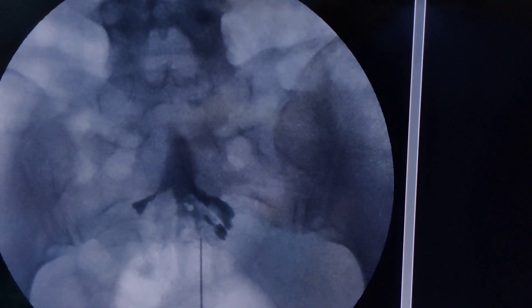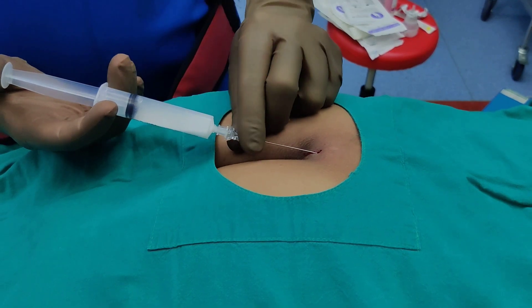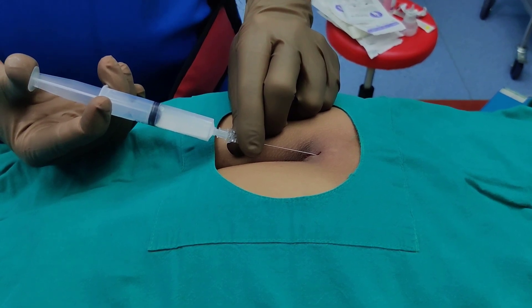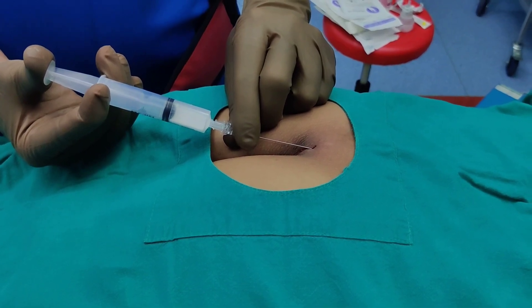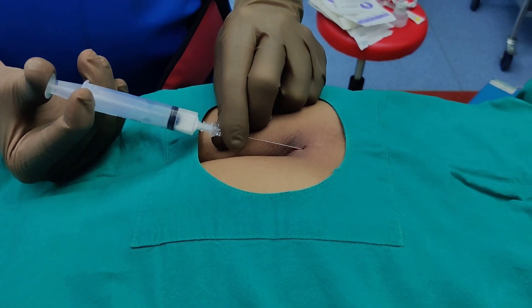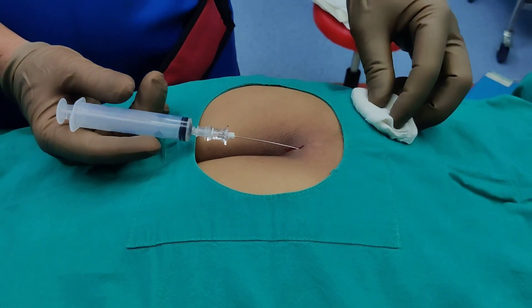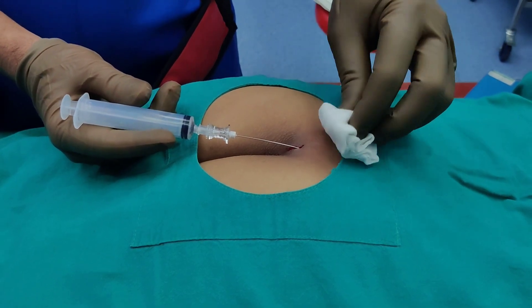The next step is to inject the mixture of depomedrone and lignocaine. If you are in the right space it should flow freely — do not use a lot of force; go slow and it will flow freely. If it is not flowing freely, even if you are in the right space, it means the needle tip is very close to bone — just withdraw it slightly and continue injecting. The injection should flow extremely freely. The patient did not experience much discomfort; you can do this under local anesthetic without any problem, or under sedation if preferred.